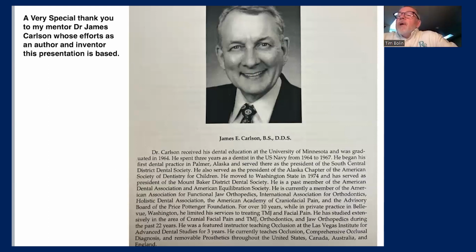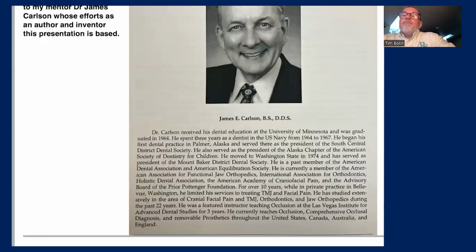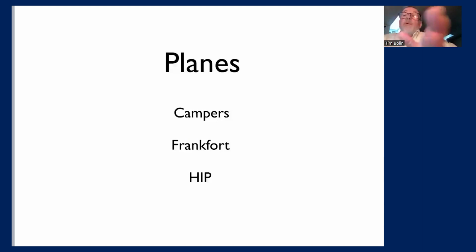Jim's just a great inventor and author, and he's brought to the forefront some really unique things, Aculiner being one of them. Developing the Aculiner and moving that forward so we can easily mount cases is a huge step forward, giving us a reference plane to work from. The planes of occlusion that we're going to talk about are Camper's, Frankfurt, and the HIP plane.